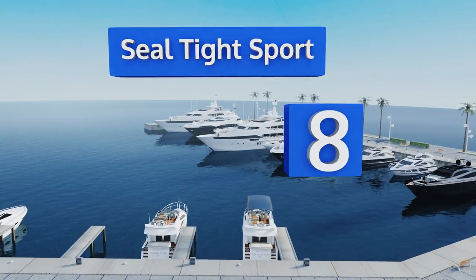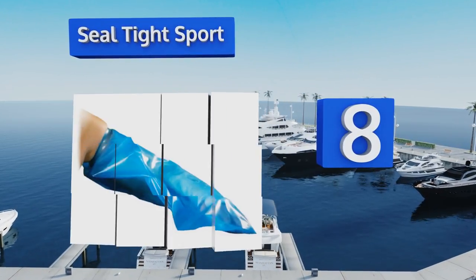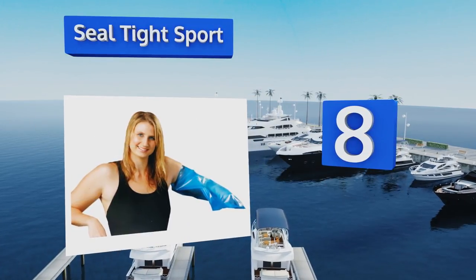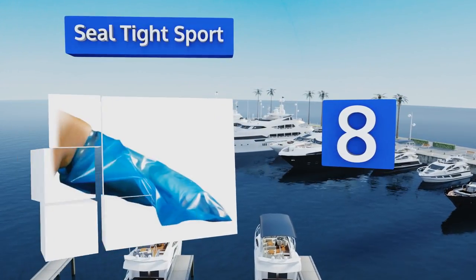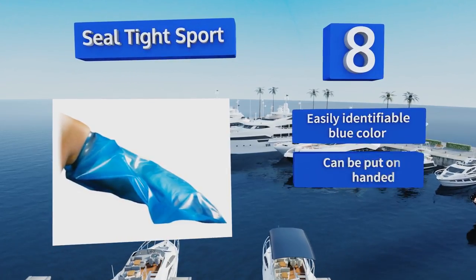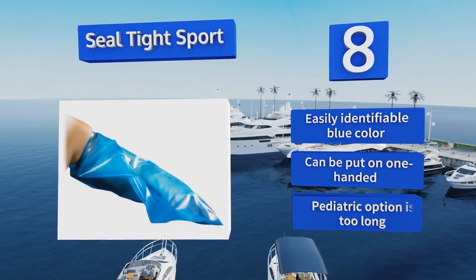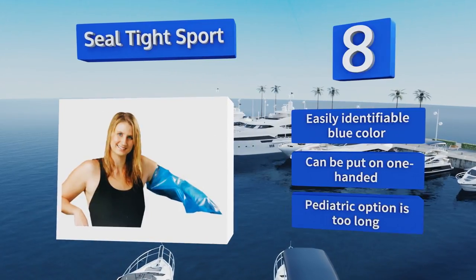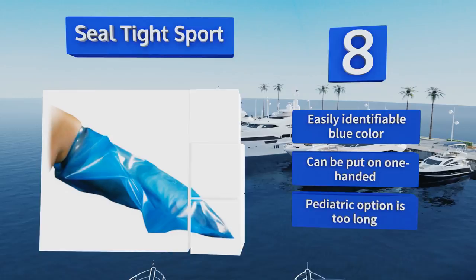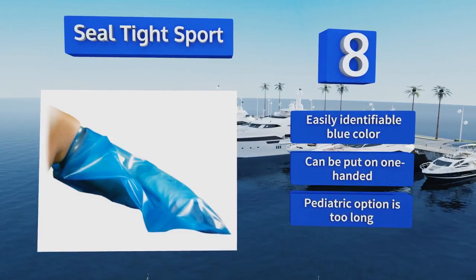Starting off our list at number eight, the Seal Tight Sport is designed to be durable enough to be used during more energetic outings. That doesn't mean it can take a beating — it isn't likely to be sufficient for playing water polo regularly, but you'll be able to enjoy time on a tube. It comes in an easily identifiable blue color and can be put on one-handed, however the pediatric option is too long.